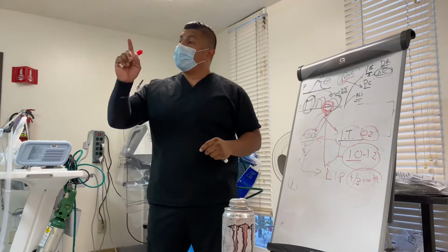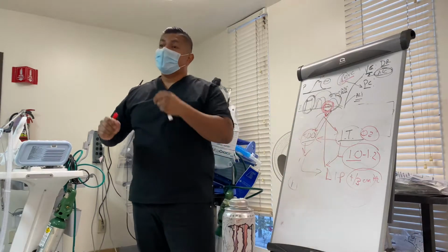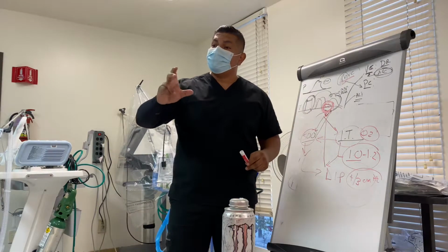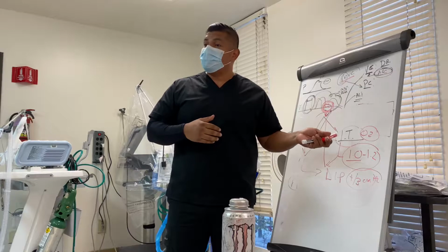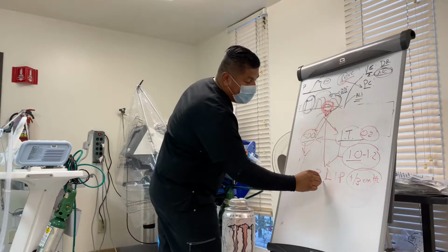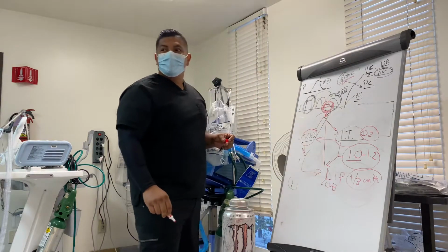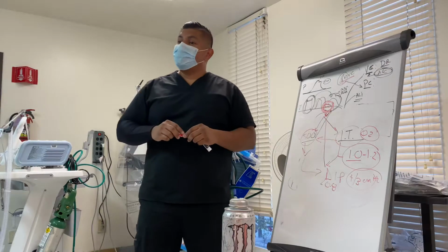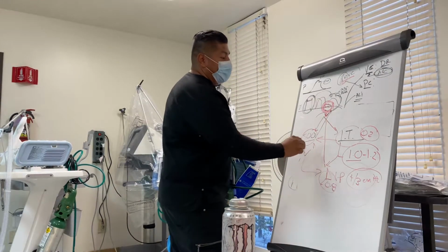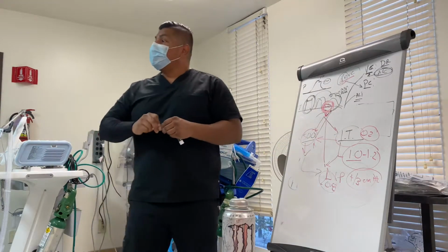The patients that will not tolerate it is probably what you're asking. The patients that will not tolerate are the patients where you have to keep on adjusting the I time, because the pressure is going to be adjusted by the machine automatically. As soon as you start noticing that your I times are going in the opposite direction, we have a problem. Because now, are you going to have enough time to deliver that tidal volume? No. Are you going to have enough time for the inspiratory pause? No.